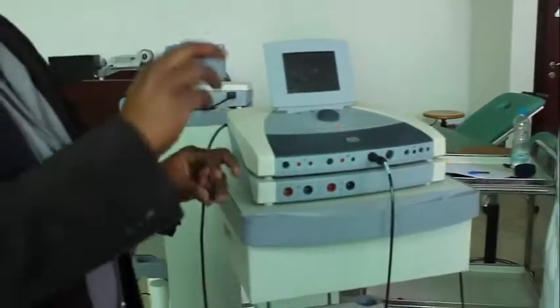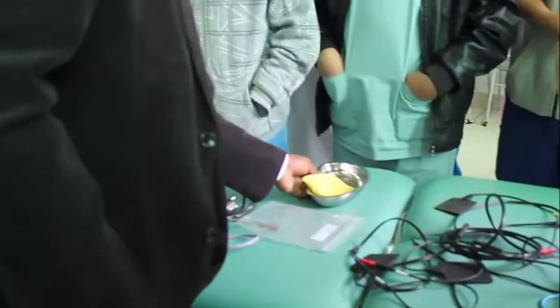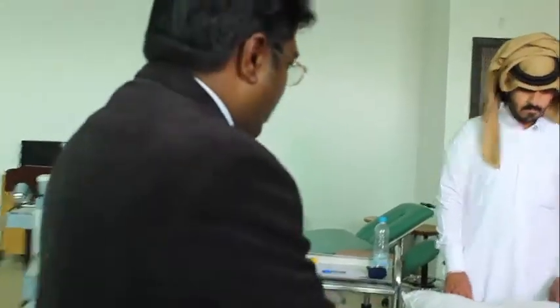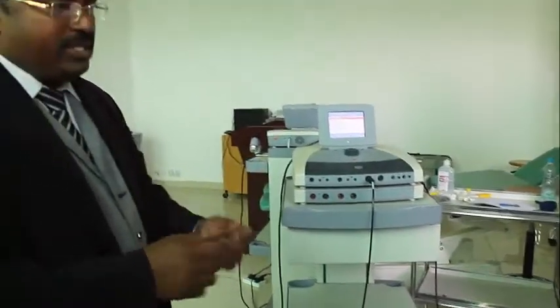So that is about the different parts of the machine. When we go to individual machines, I will show you more related parts. Definitely you require a kidney tray, because it's shaped like a kidney, water, and sometimes gel. Some machines require gel. The gel is not here, I will show it in the next classes. So there is gel, water, kidney trays or any other trays, towels, tissues, straps. These are all the materials you require for stimulation of electrical current to the patient.